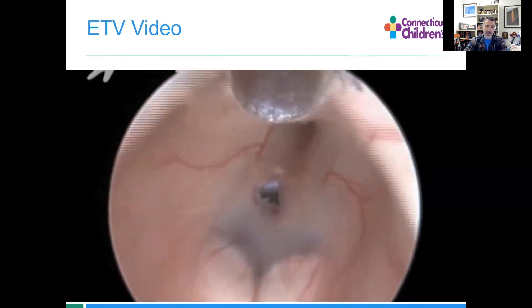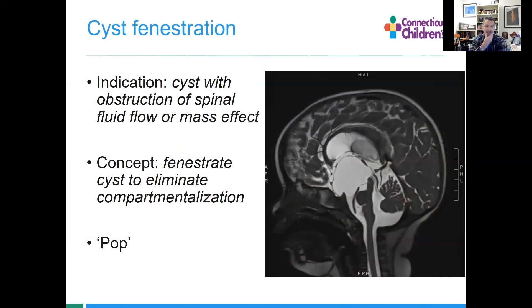We'll come back through with our endoscope and confirm — fornix, all those veins, everything looks good and we're done. It's a quick operation; you can do this in less than 10 minutes once you get used to it.